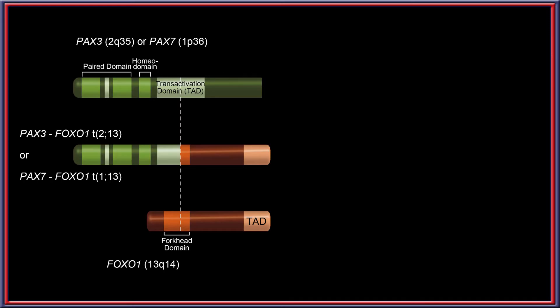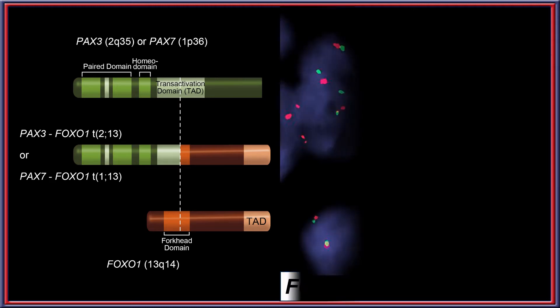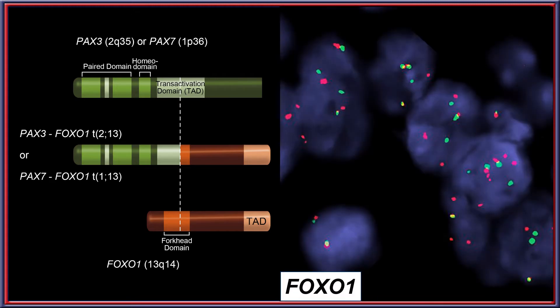The PAX3 or PAX7 translocation with FOXO1 can be easily detected with FISH, demonstrated here with a FISH break-apart probe for FOXO1 in this example of an alveolar rhabdomyosarcoma.